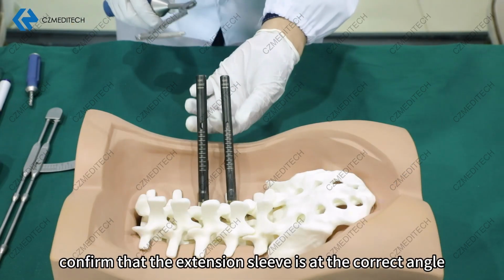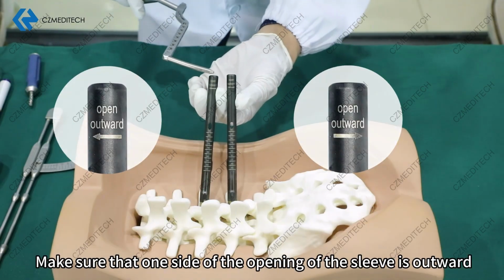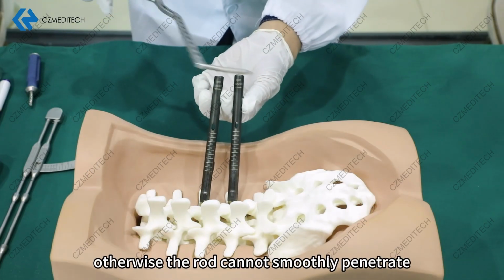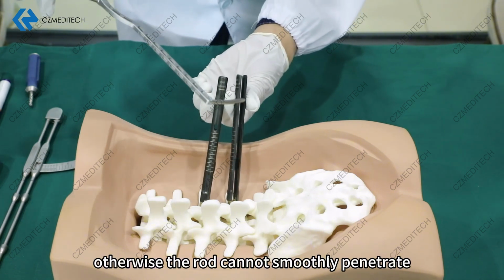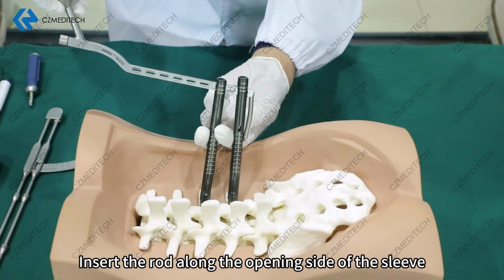Before threading, confirm that the extension sleeve is at the correct angle. Make sure that one side of the opening of the sleeve is outward. Otherwise, the rod cannot smoothly penetrate into the appropriate position. Insert the rod along the opening side of the sleeve.